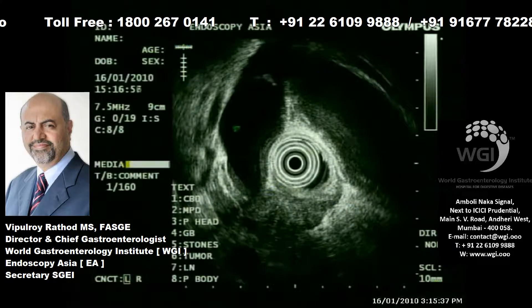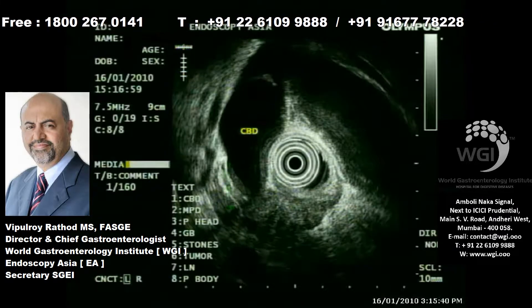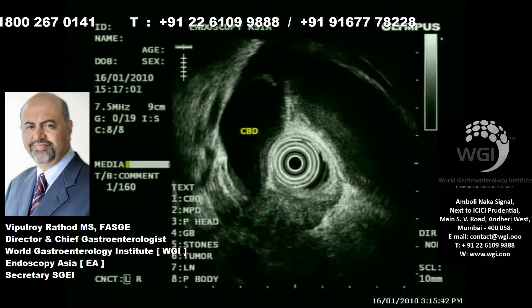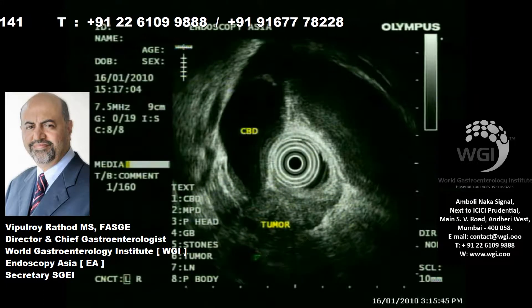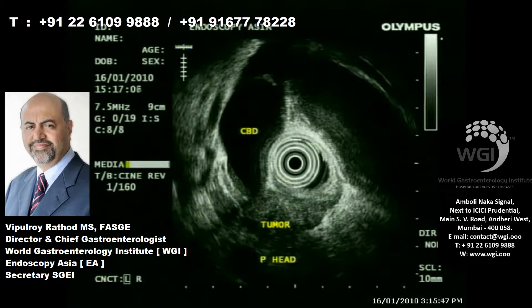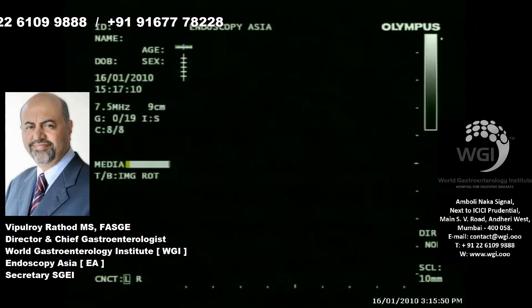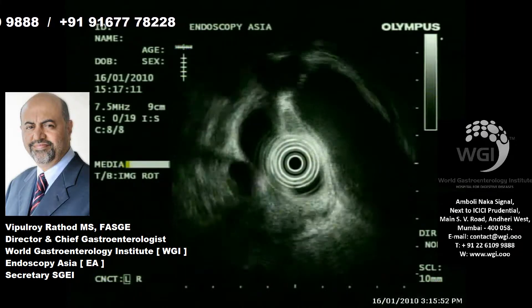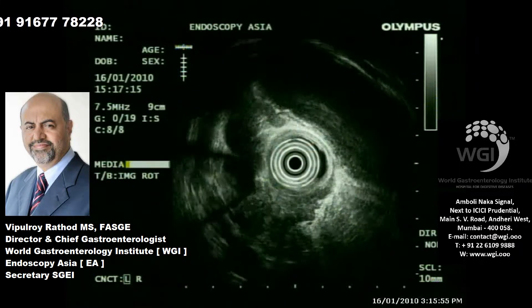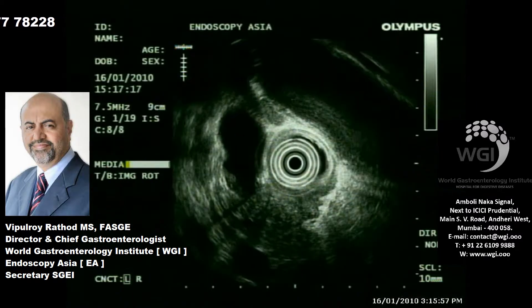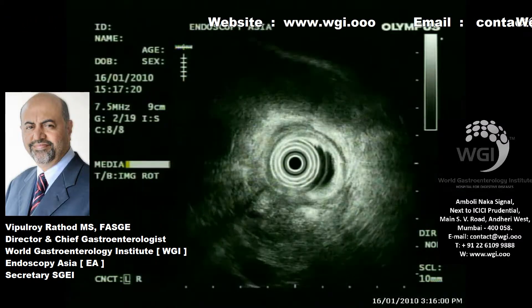You can see the dilated bile duct and a peri-ampullary tumor occluding the lower CBD, as you can see here. It could be arising from the pancreatic head, and there is absolutely no doubt the lesion appears fairly resectable, as none of the major vessels are close to the primary lesion, as you can see here on scanning.